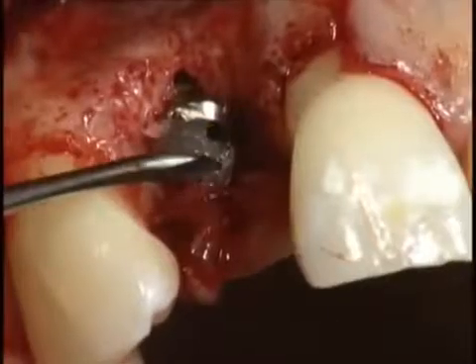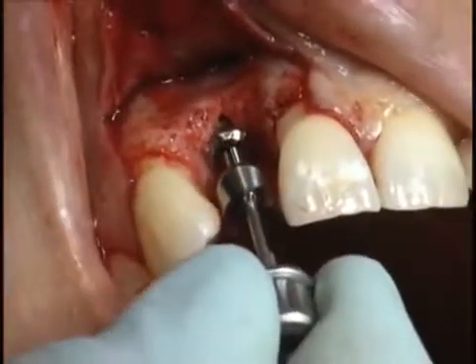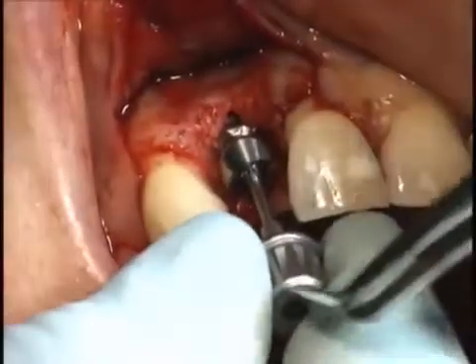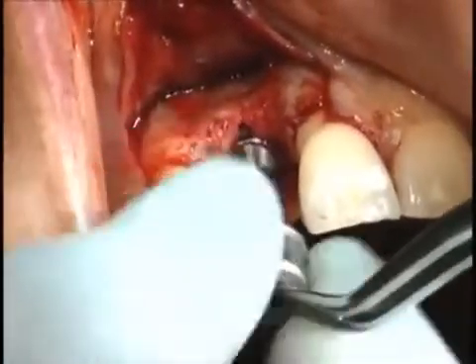The inside of the implant is now coated with Nebacetin ointment. For partially submerged healing, a beveled healing cap is screwed into the implant by hand using an SCS screwdriver.